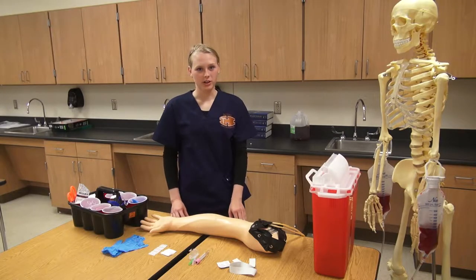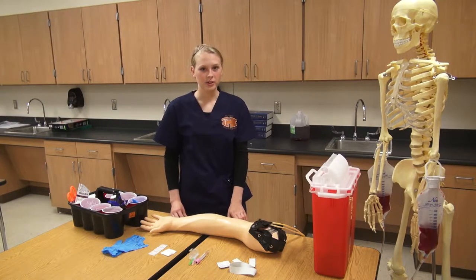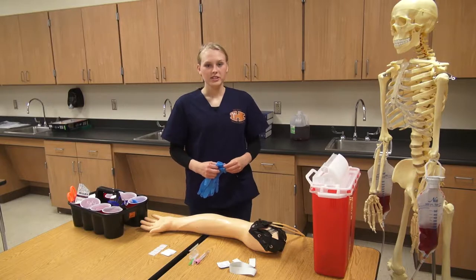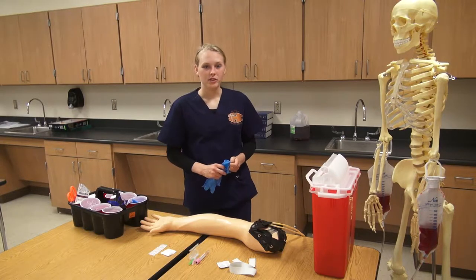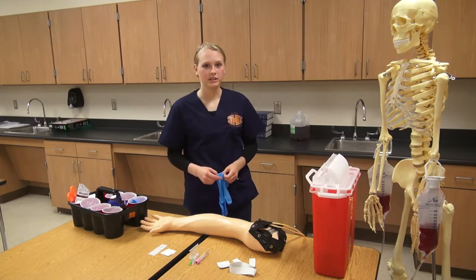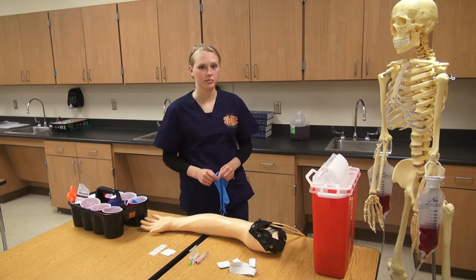Before performing your actual blood draw, you need to make sure that you have identified yourself as the phlebotomist to your patient, confirmed that you have the correct patient, and obtained consent. The first thing you'll do is make sure you have your PPE on, which in this case will just be gloves, as we do not expect any splattering of blood.